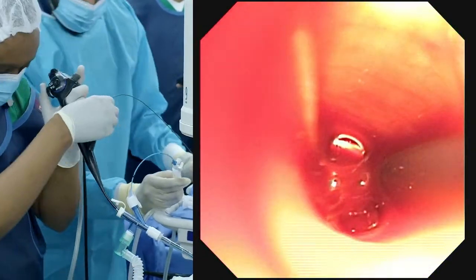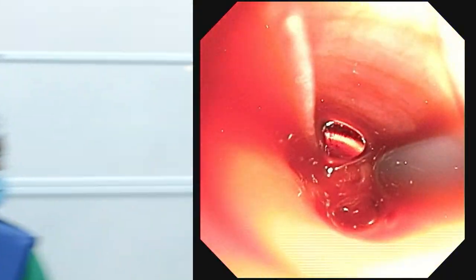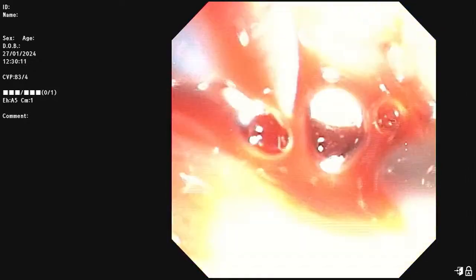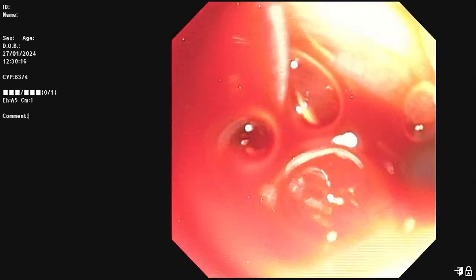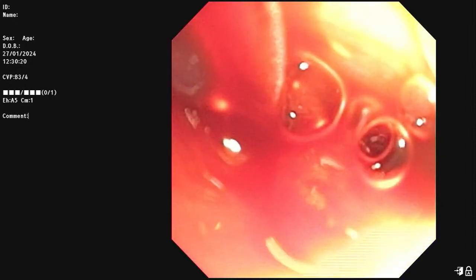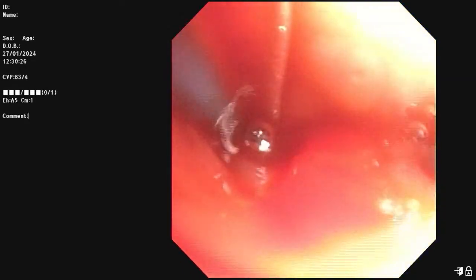Yes, let's check with the fluoro. So keep going until you feel resistance. Okay, then come back about 2 centimeters. Yeah, we're taking from a different segment. That's good. When you're ready, I'll put the probe. That's more like the anterior basal where we can take it.